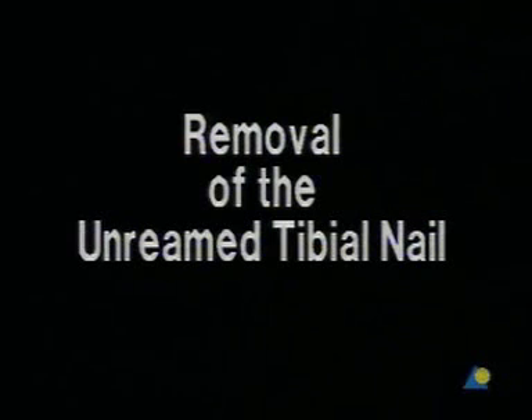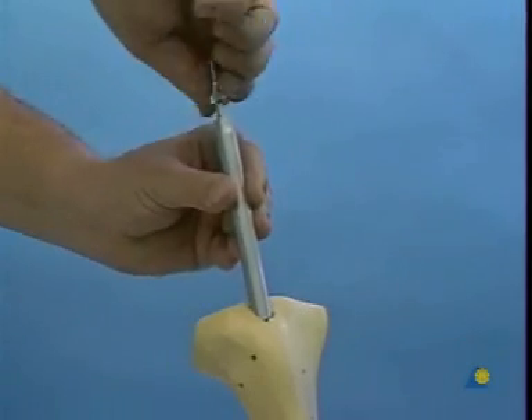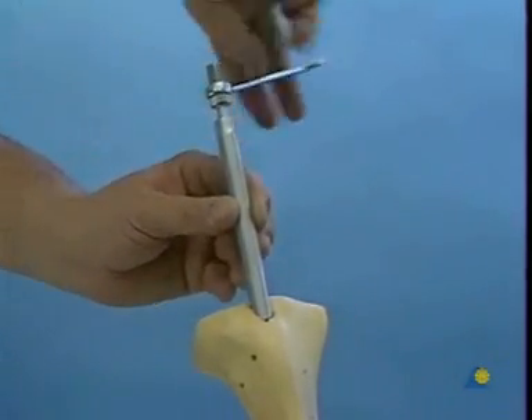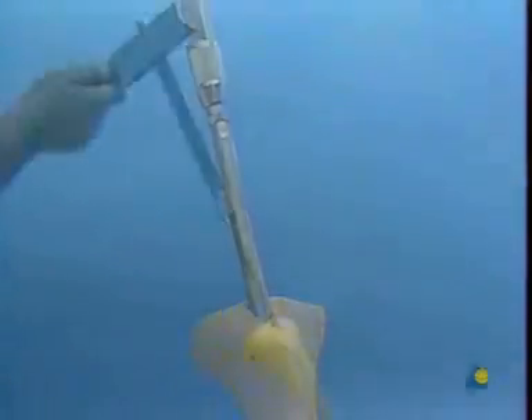Removal of the unreamed tibial nail. Having removed the locking bolts, the coupling block marked Extraction is placed on the proximal end of the nail and fixed with the connecting screw. The inserter extractor is positioned in the nail and the nail is removed by gentle blows of the slotted hammer.